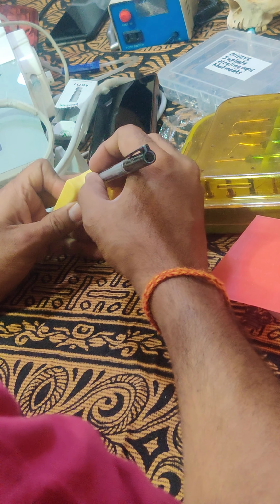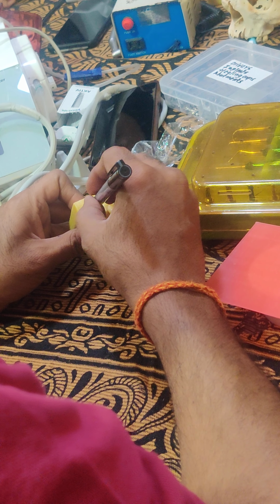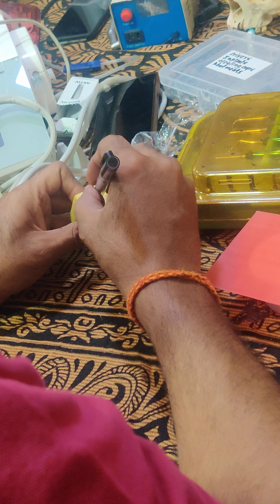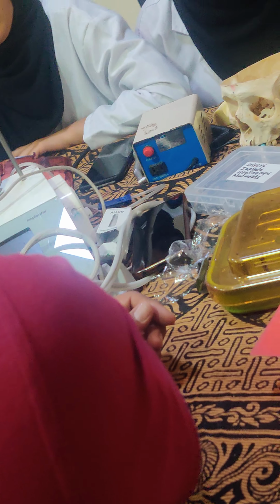Okay, floor I have marked. 1 mm above the floor, you are going to open a window. This is also known as lateral wall approach. Direct sinus lift is also known as lateral wall approach. Okay, I am going to open a window here. I have marked the window. Okay, Rafi saw the window?